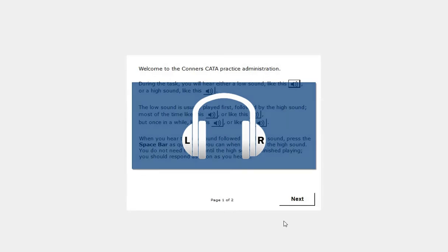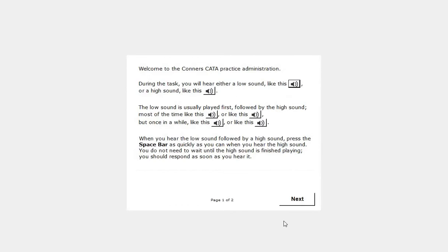Once this is done, explain the task by reading the instructions displayed on the screen and using the sound buttons in the order that they are presented. The instructions should be read loudly and at a reasonable pace so that the respondent can hear you through the headphones.